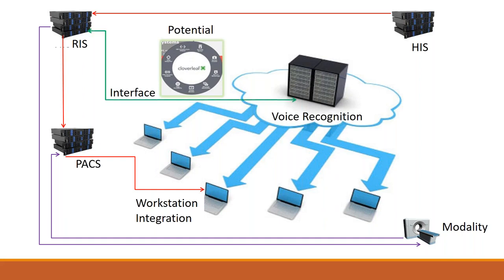And then you have the interface between your voice recognition and RIS. So from the workstations, the doctors are dictating and taking that information back and forth from the RIS and putting those reports back into the repository. And then that clover leaf is often something in the middle that connects all these different products.